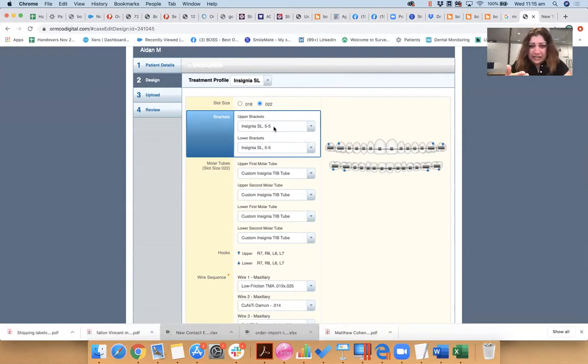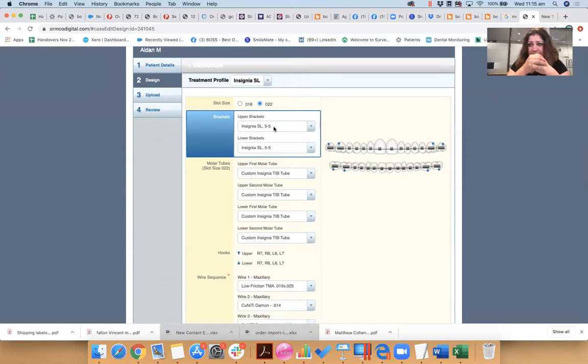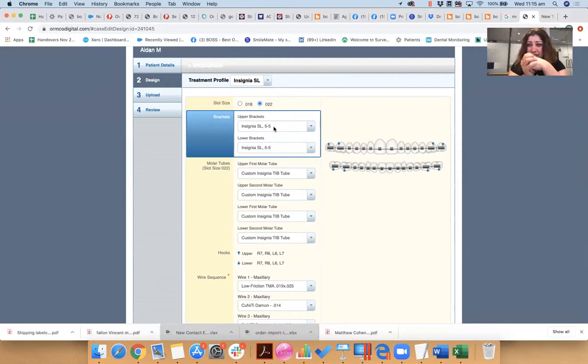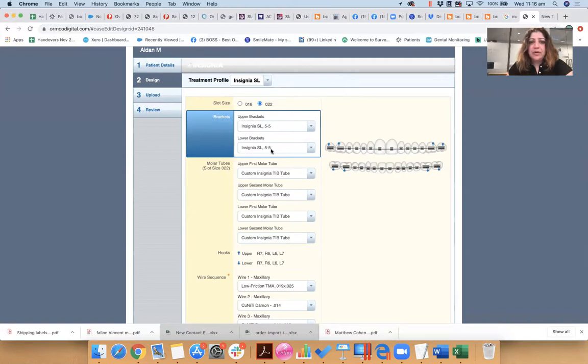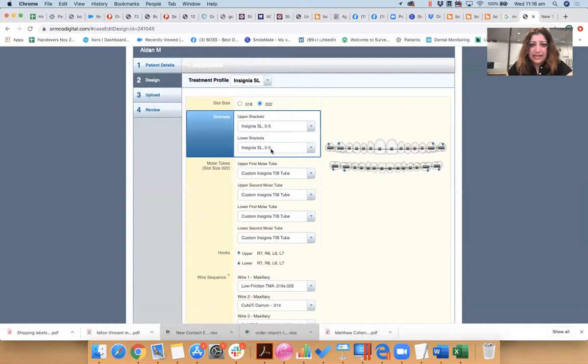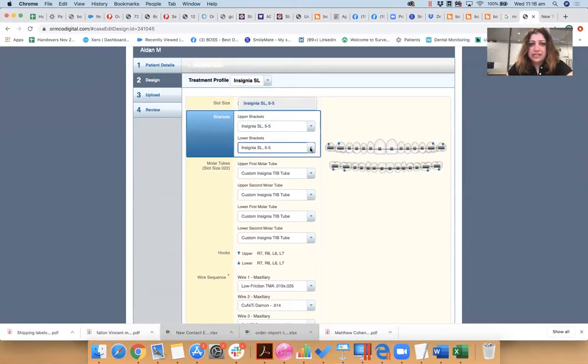So I'm going to order not stock Insignia self-ligating, which is what it says here. Insignia self-ligating. The base of the bracket is highly customized to adapt to the anatomy of the tooth surface of the patient, as well as deliver the right torque or the right movement for that patient.